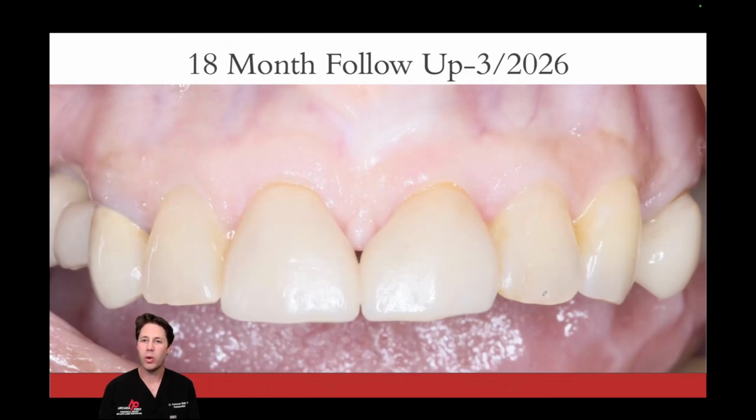This patient only wanted two new crowns. She did not want to close the space with orthodontics, an older female patient. So, given the circumstances, the final restorations were done as such. We close the space, we close the diastema, and the patient's happy.